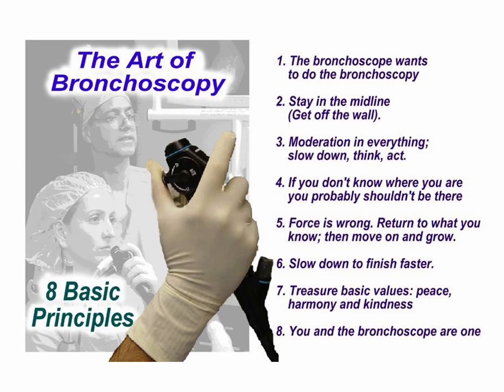Its success depends upon appropriate patient selection, careful equipment handling, thorough knowledge of airway anatomy, close collaboration with cytopathology, and disciplined procedural technique. In the next module, we will focus on the technical aspects of performing conventional TBNA safely and effectively, including needle positioning, puncture techniques, and practical procedural tips.